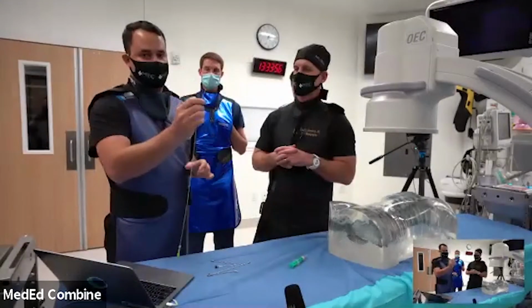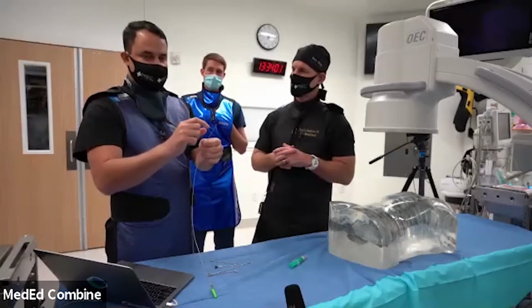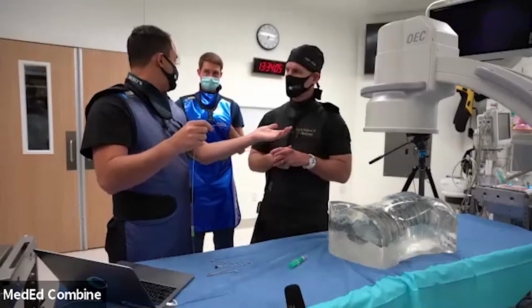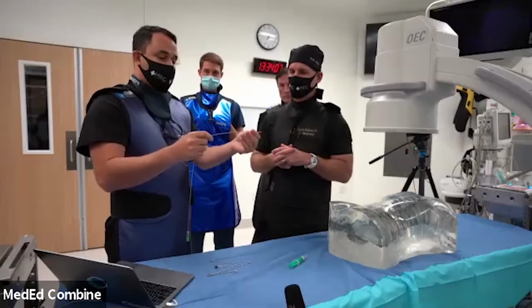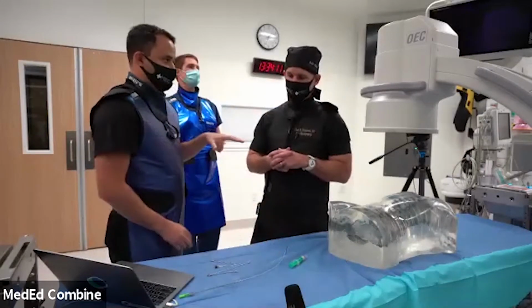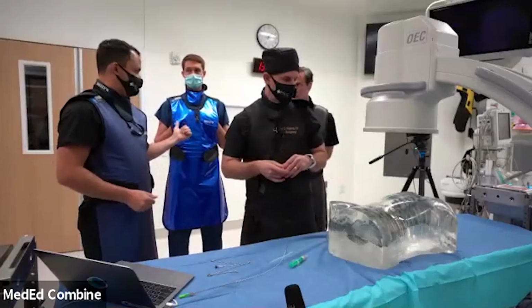So one thing the rep will do on their iPad is change the leads and ask the patient, is this where your pain is? Yep. So as long as you get good coverage, T8 to T10, they're able to do the rest from there. We're just the technicians. We're just putting the lead in there for you, and the stimulator, the rep does the rest of the work.